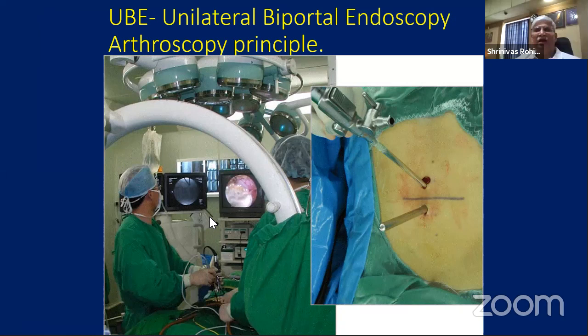We started with the fixed interlaminar approach. Now we are coming with the mobile interlaminar where we can use two ports. This is Dr. Son.